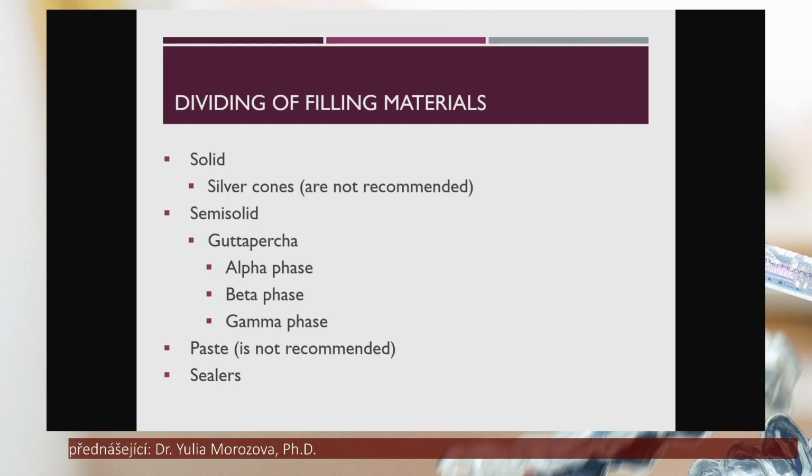And the next group, these are the sealers that are nowadays widely used, but just in combination with gutta percha.